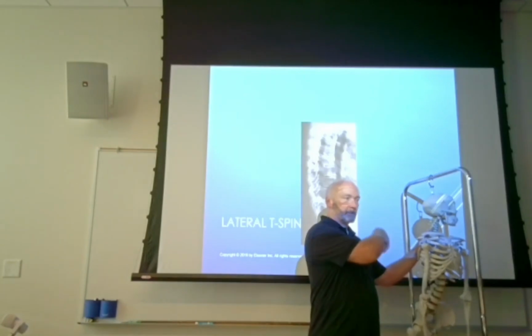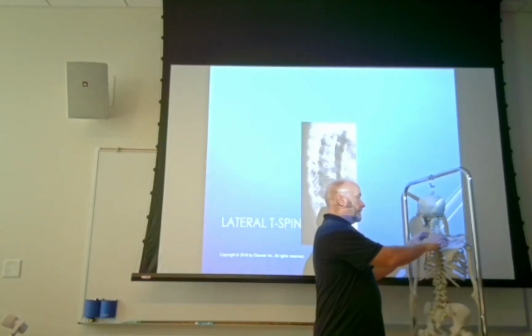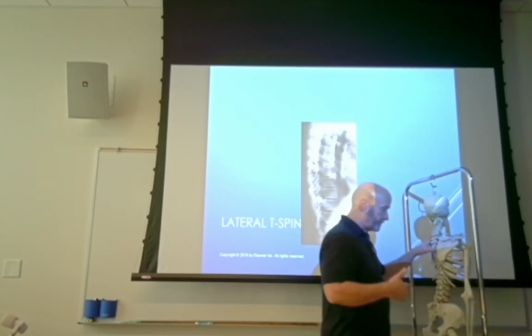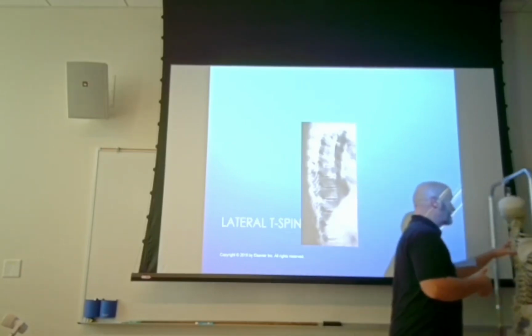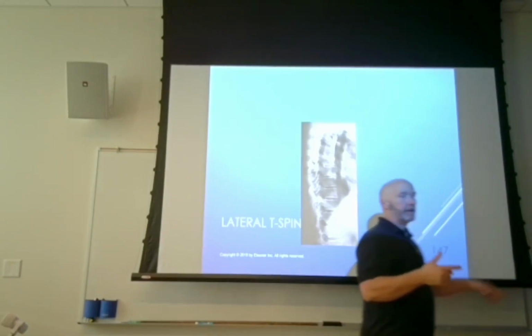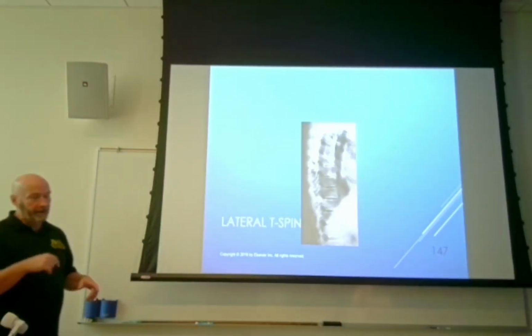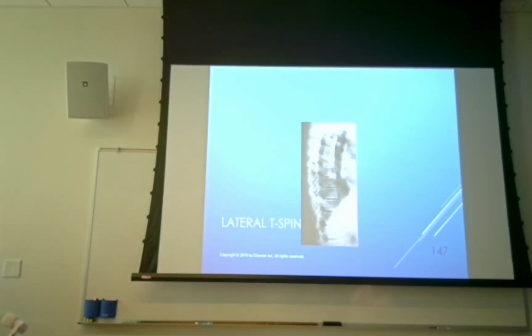So AP was on the upside. That means that PA would be on the downside with caudal angulation, right? So on the C-spine, we're going to see the intervertebral foramina on the oblique, right? We're going to see PA on the downside, AP on the upside. And then we're going to see the zygapophyseal joint on lateral.